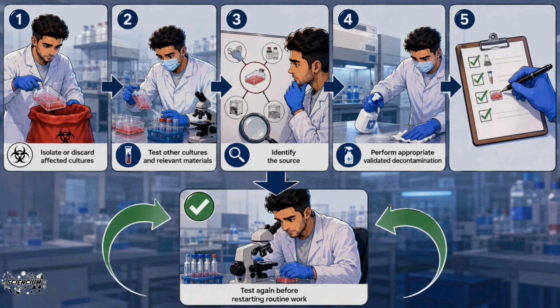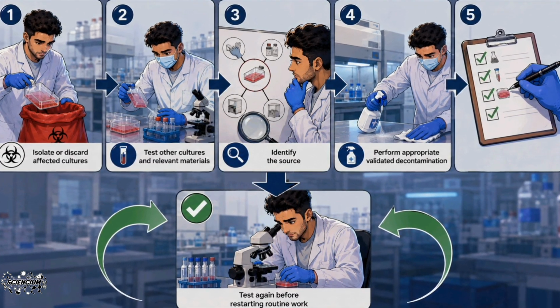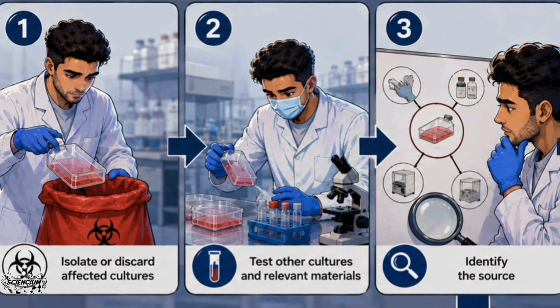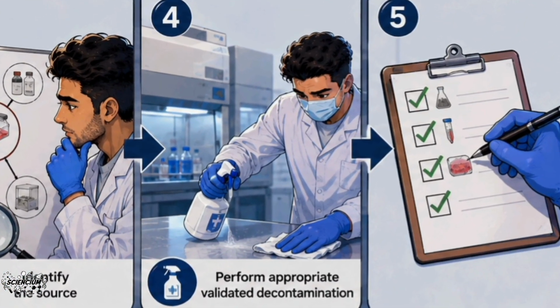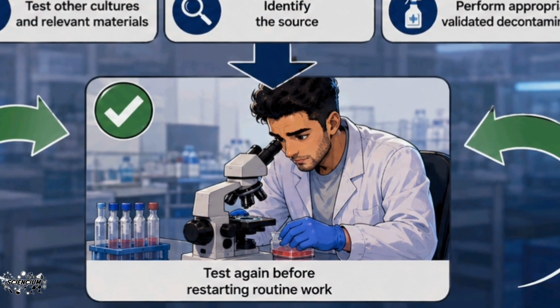If Mycoplasma is confirmed, don't simply add antibiotics and continue working. Isolate or discard affected cultures. Test other cultures and relevant materials. Identify the source, and perform the appropriate validated decontamination procedure. Then test again before restarting routine work.